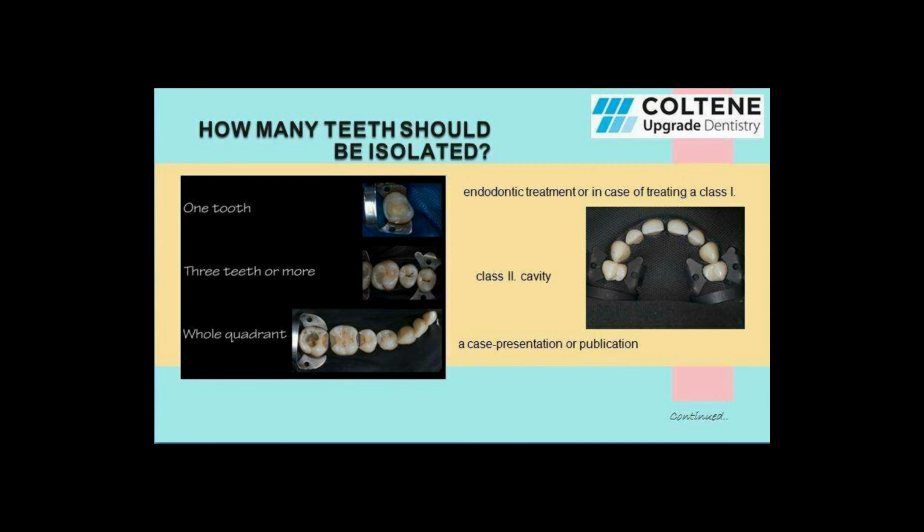And the picture on the very right-hand side shows the frontal area. In the case of the frontal area, if you're treating any of the anterior teeth, it is always advised to isolate the complete frontal region.